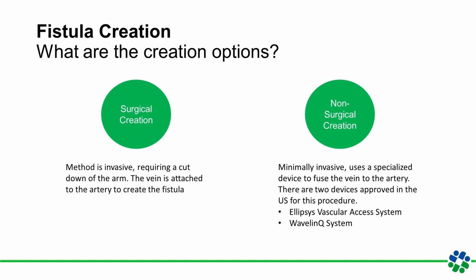In contrast, the non-surgical creation is a minimally invasive procedure, and it employs specialized devices such as the Ellipsys Vascular Access System and the WavelinQ system. These innovative devices allow fusion of the vein to the artery without a large incision. The benefits of this approach are numerous: reduced pain, faster recovery, and the absence of a visible scar.